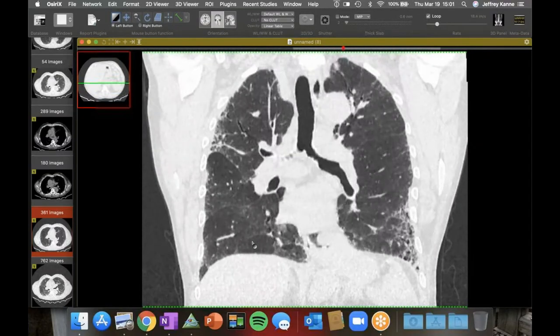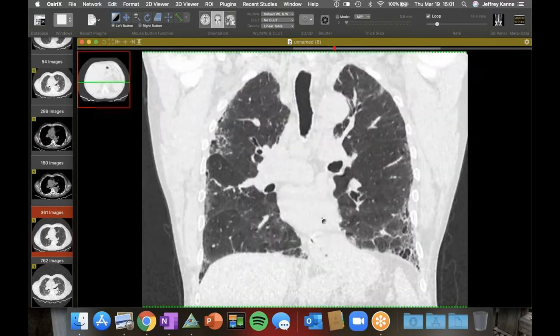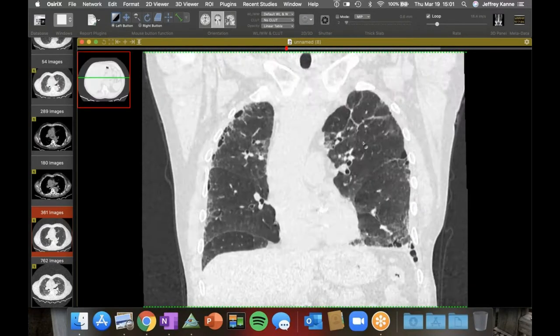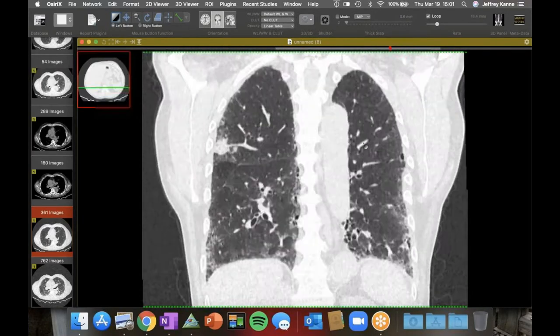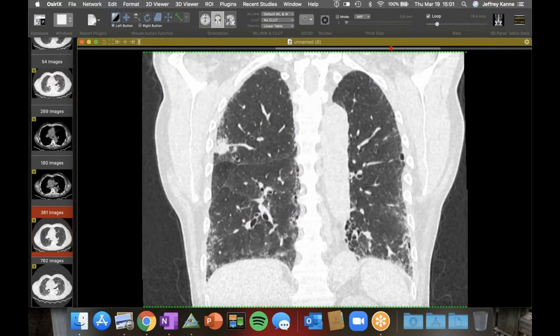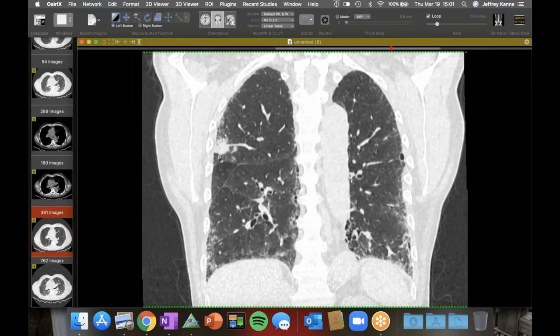It's very interesting. But this is the coronal, and David, you can see what David was pointing at, this nice mosaic attenuation. And it is multilobar. It is bilateral. The question is, is it black enough? We don't have expiratory images. Another important thing I didn't mention is that when you're looking at these dense areas, multiplanar reformats are very helpful because you can see it's very rounded. Conglomerate fibrosis, in my experience, may look mass-like on the axial plane, but on a different plane it's clearly tugging in and doesn't have all these convex margins. Yeah, that can be helpful.